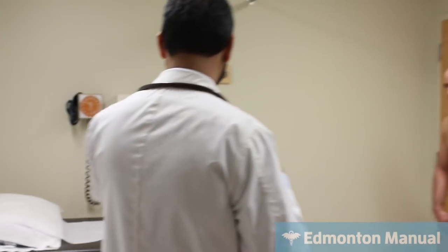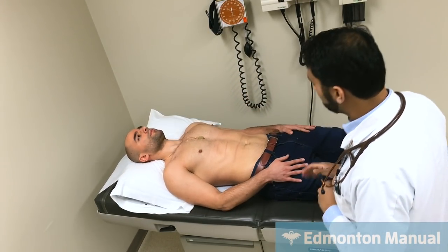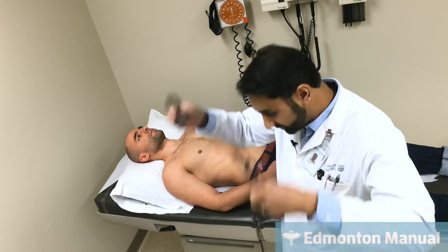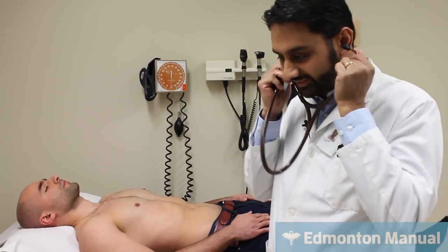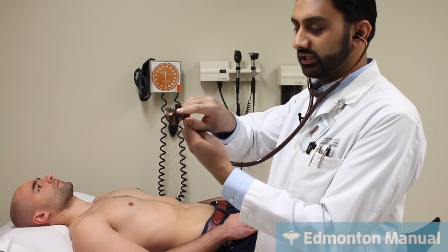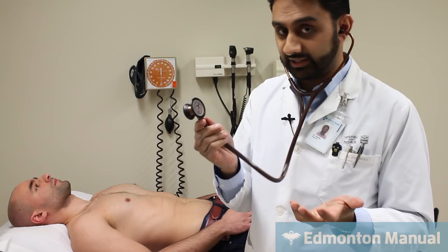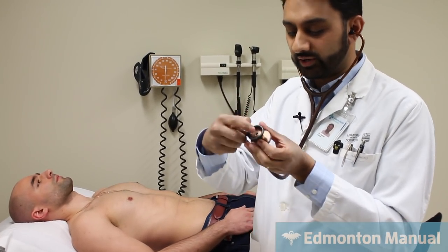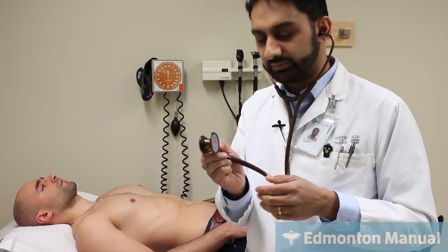What we're going to do now is demonstrate the use of the stethoscope, how to hold it on a patient. So we have our patient here, and one of the key things is the earpieces are going to point forwards, and then you put them in your ears, obviously. One of the key things with holding it is that some people find that if you have your finger touching it over here, you can get a lot of noise. Generally, you do want to tap and make sure you're on the right side. So I'm going to flip that over so I can hear. I'm on the diaphragm side, but even though I'm not on the bell side, I can still hear a lot of noise just putting my finger here. You do have to try a variety of things to see what works best for you.